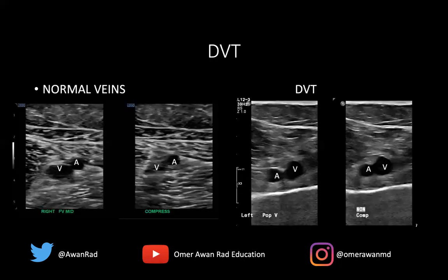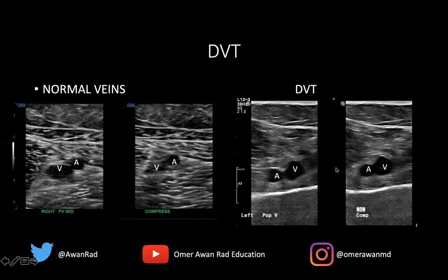Here's what a DVT looks like on ultrasound. On the left side of the image, we have a normal ultrasound exam — this happens to be the right mid-femoral vein. These dark black areas are the vessels; they're ovoid because the probe is transverse to the patient. This is the subcutaneous fat, this is the muscular layer, and we have the vessels here. The vein tends to be bigger than the artery. This is the femoral vein, and this is the femoral artery.